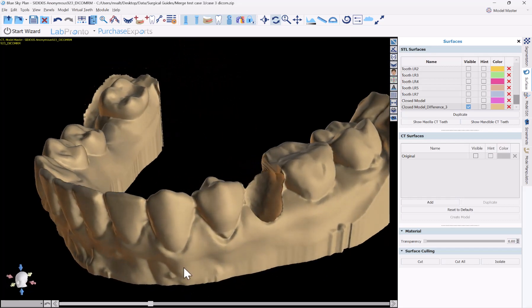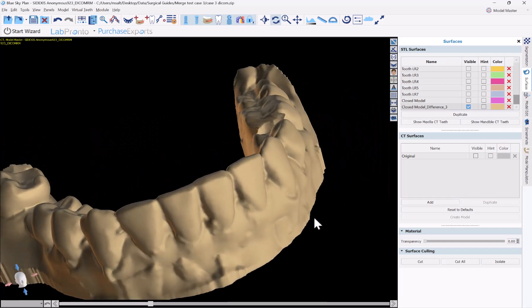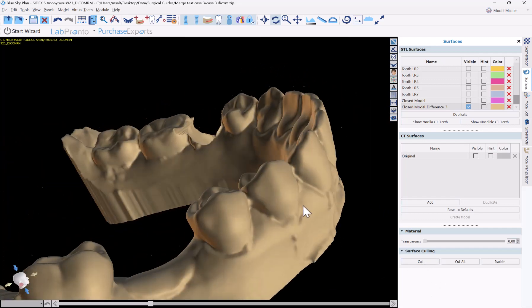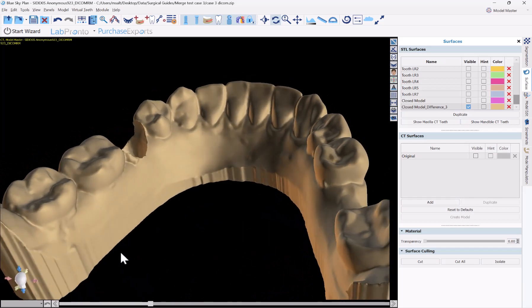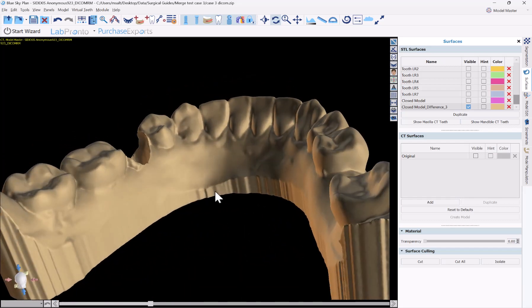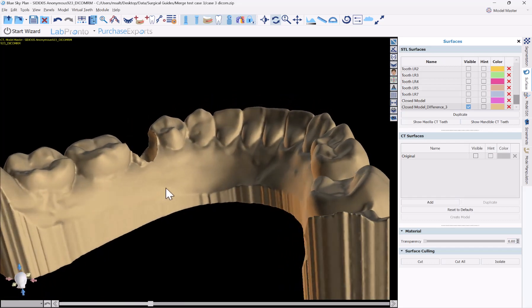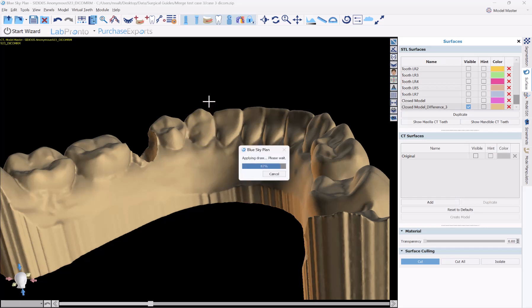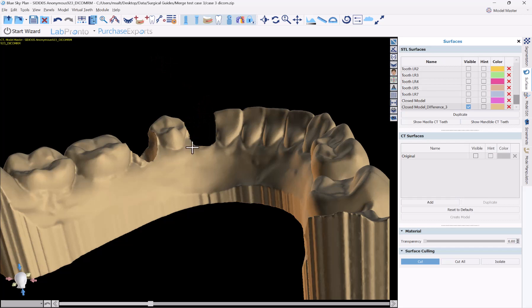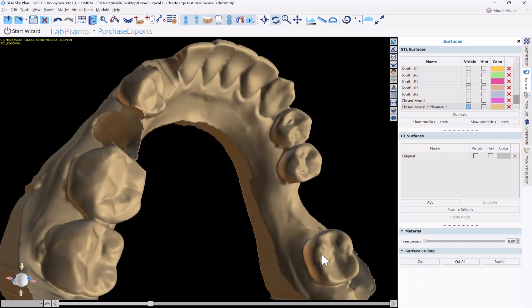That was Dr. Corey Glenn's technique. Another technique that's been in the software the longest is just using the cut lasso tool. It's a good idea to use it from the lingual side to the buccal side to make sure no other surfaces behind the model get cut accidentally. I'll click cut, hold down the shift key, and carefully lasso around the area I want to extract. The cut wasn't done perfectly, so I'll click escape to turn off the cut — and here is our extraction.